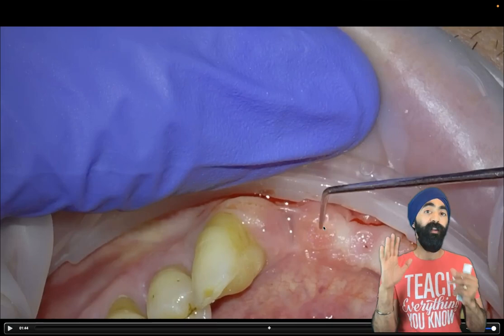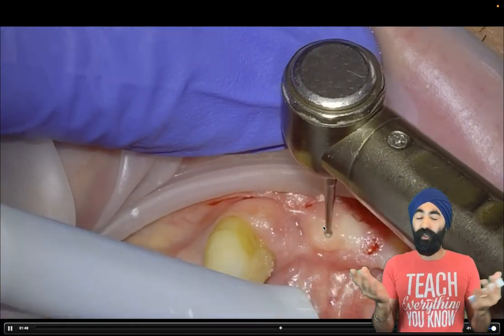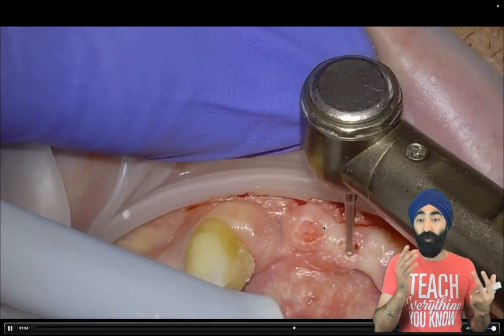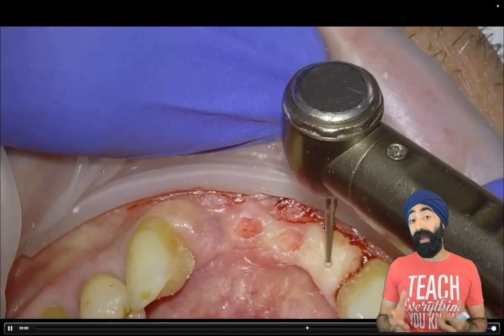So now you know where to adjust. The patient is nice and numb, and you can go ahead and use your Thermocut burr. Here I am — full speed, no water. I make a joke to my patient: I say, 'It's going to smell like a barbecue.' It's not so bad, actually. The patient doesn't feel anything, and you'll see for yourself you don't get much bleeding because it kind of burns the tissue. So this is a great way to manage soft tissues.